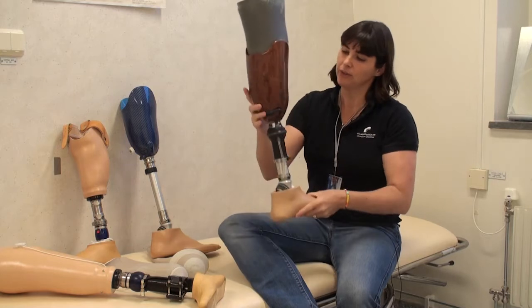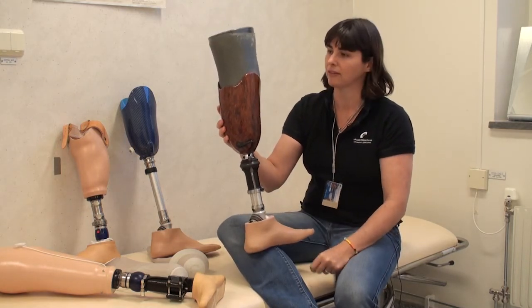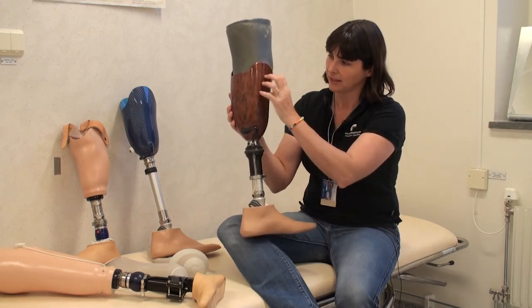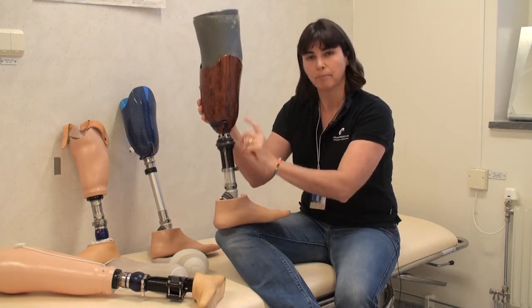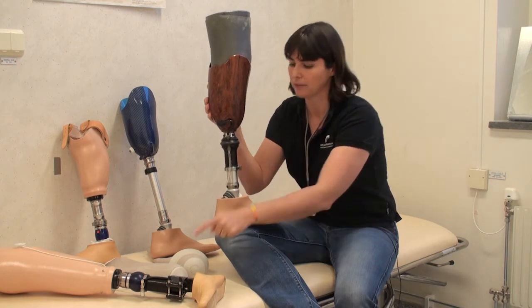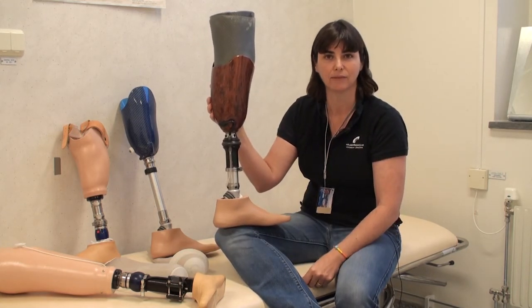The newest technique that we have is a vacuum suspension. Here we have a vacuum seal around the top of the prosthetic socket, and every time the patient walks, this component compresses and actively sucks air out from between the liner and the prosthesis, so we have a very good active vacuum seal.